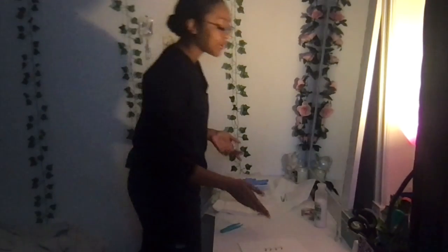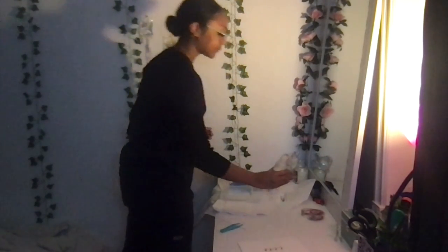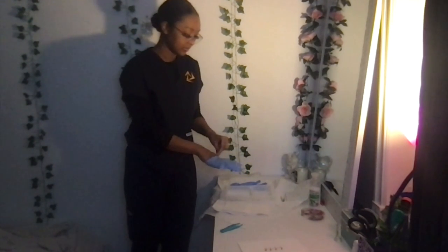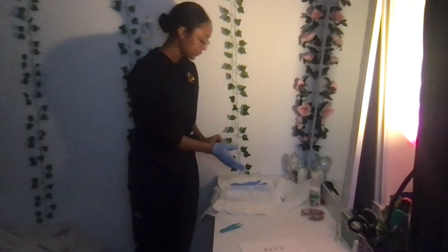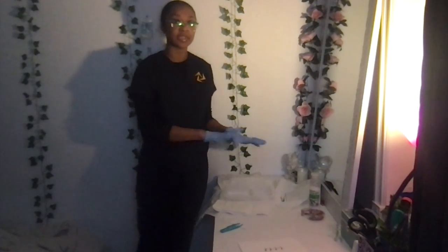Since my normal saline was not part of the kit, then I will pour my normal saline before I put on my gloves. I will hold it at the label to make sure that if any splashing occurs, then it will not hit the label and ruin any of the writing. So I pour it and reduce any splashing, and make sure I don't hover over the workspace. Then I can put on my sterile gloves, my non-dominant hand first. I can now touch everything in the aseptic workspace.